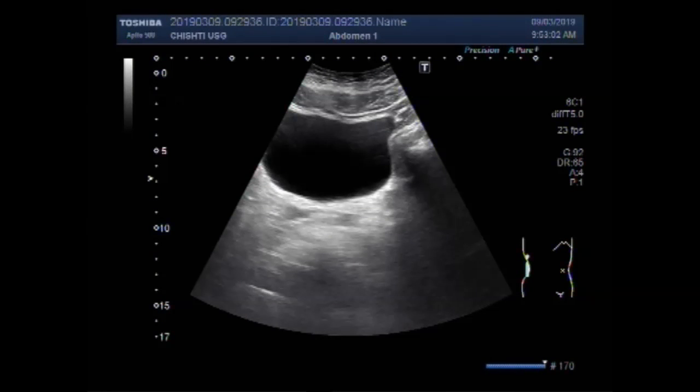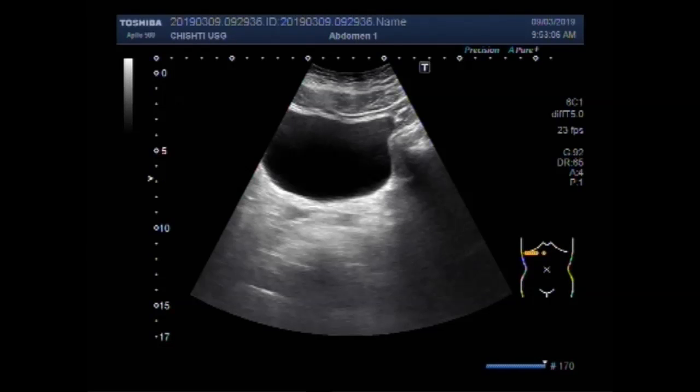Dear viewers, I hope you are all fine. This ultrasound video shows a mucocele of gallbladder.